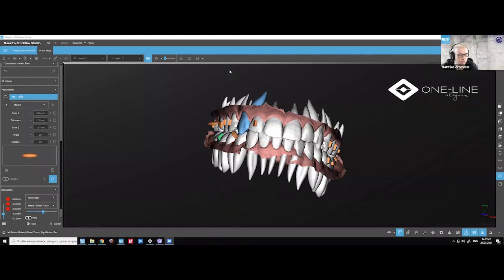Another question: how do you remove it after suck down? This is what I answered right now. You remove it like all other attachments. There's no problem at all. Especially if the sheet has a protection foil, it comes out more easily. Duran from Scheu Dental doesn't have a protective sheet, so it sticks to it and then it breaks off. But with the Pro Plus, it has a protective sheet, so it's not really a problem.